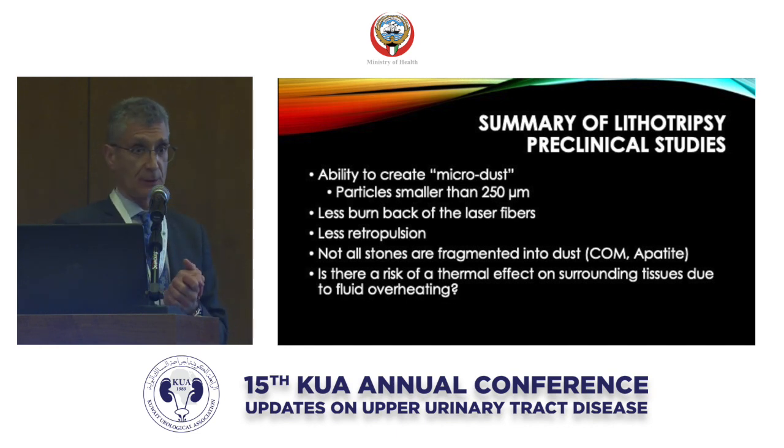So in terms of the clinical experience, first of all, I think to preface this by saying that a lot of the clinical data is not really good data. It's a lot of small series, single institution, retrospective, and so we know there are limitations and biases, obviously, with those types of studies. Hard to really take much from that literature. Many of us who started using this laser were looking to that literature to give us guidance on what the proper energy settings and pulse frequency should be. Of course, many of these studies use quite variable parameters, so it's a little bit hard to actually assess that.